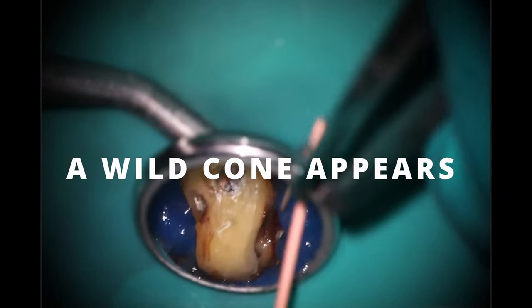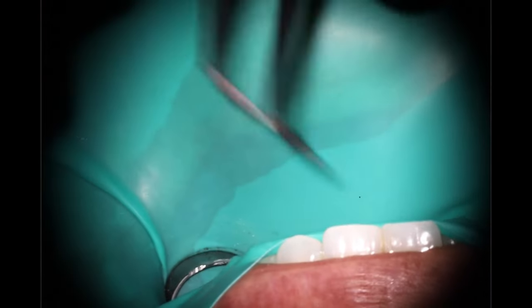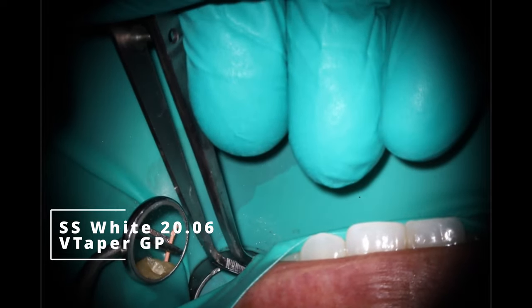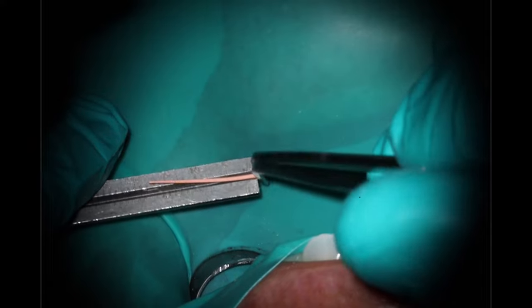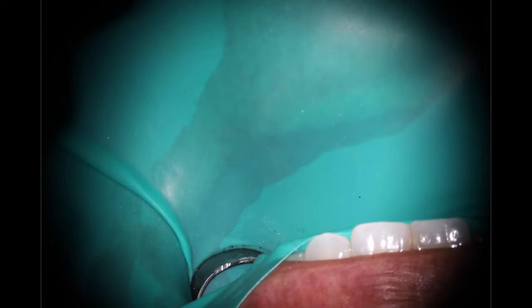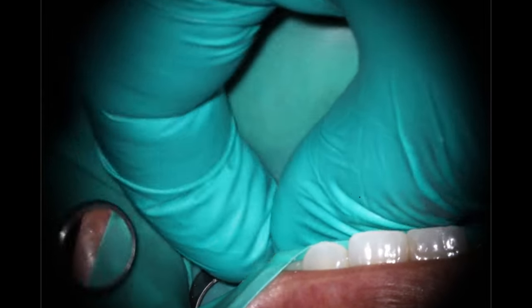One of the reasons I love this condenser is it's NiTi and stainless steel. You can see I'm using the stainless steel side to clean it up. And what is that? That is a cone — you guys are actually going to see me do warm vertical here. The reason why I went with warm vertical is because I was a little concerned about my length control with such a weird access. Trying to get that beta tip into this space is really difficult. So I was measuring — got approach was a little bit short of where I wanted to go.